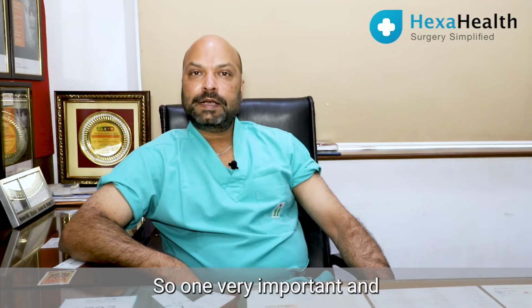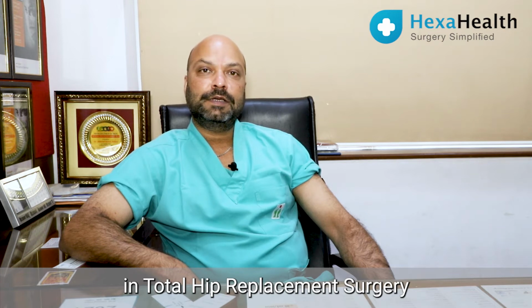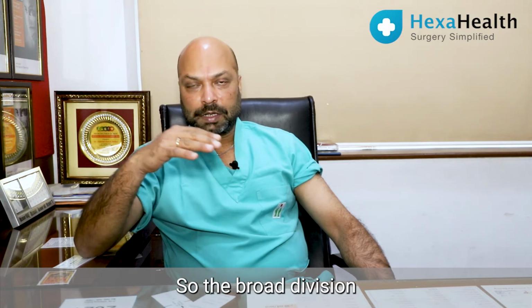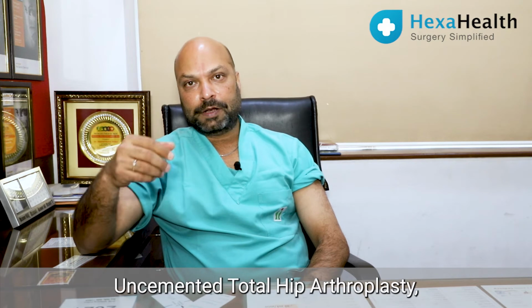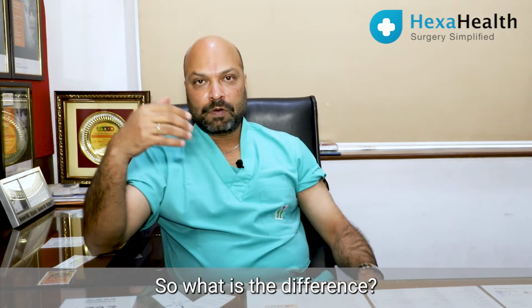So one very important and technical point when we talk about the implants in total hip replacement surgery is to differentiate between the implants. The broad division you can classify between two types. One is called cemented total hip arthroplasty, second is uncemented total hip arthroplasty, and there is a combination also which is called hybrid. So what is the difference?